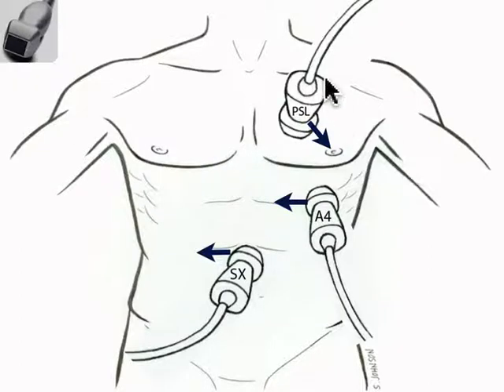So recall that last year when I came to you, we talked about the different locations to point the probe, and the one way is here against the parasternal long axis. This is where, as its name suggests, parasternal, para means next to, sternum. You place it right along the edge of the sternum and you aim the indicator down towards the patient's left, somewhere between, if their arm was at their side, their left elbow or their left hip, in this kind of direction.